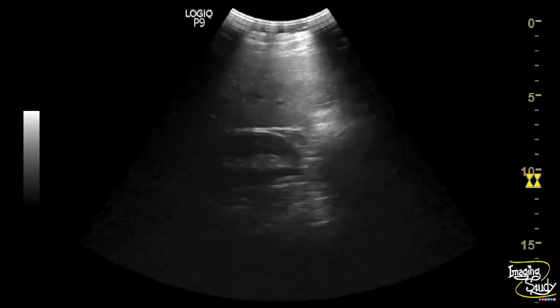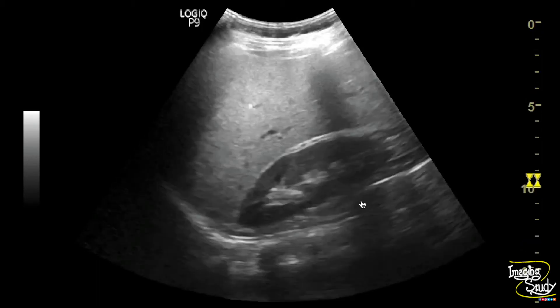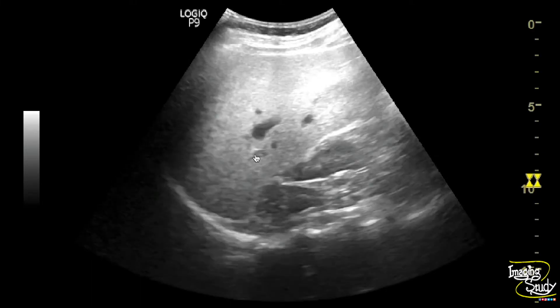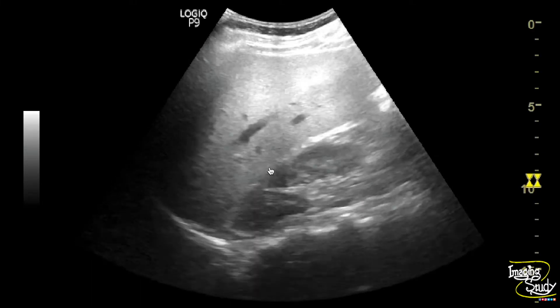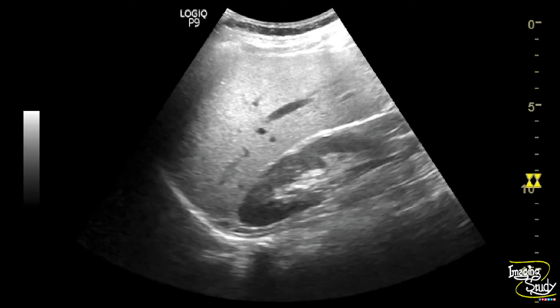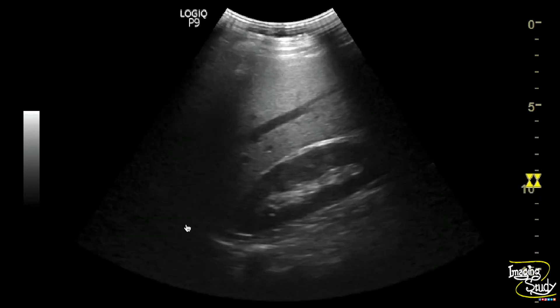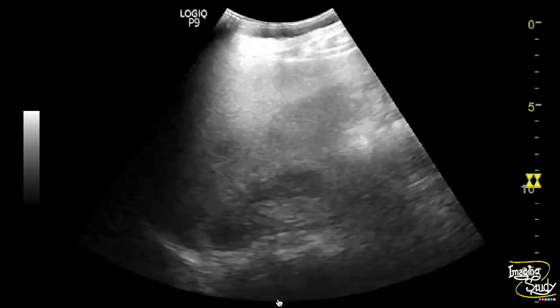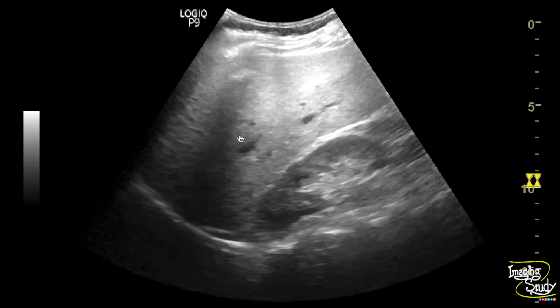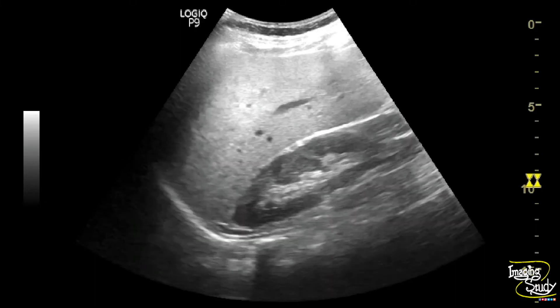Here is the right kidney for comparison of the echogenicity, and you can see the difference between the echogenicity of the liver and right renal parenchyma is prominent. The vessels and diaphragm are well visualized. These features indicate a mild hepatic steatosis or mild diffuse fatty change in liver.